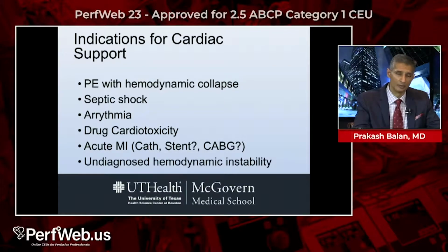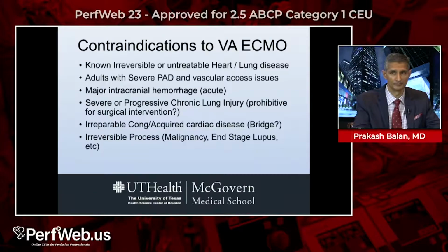Undiagnosed hemodynamic instability, and in many ways, the reason I put this in is ECMO gives you the time to figure out which of these other potential causes has resulted in this hemodynamic collapse, and thus allows you that opportunity to treat and take care of these patients.